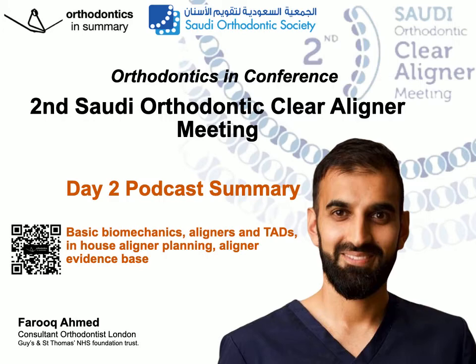So Tommaso started off describing the advantages of using aligners for periodontal patients, how their health outcomes are better with respect to gingival index, bleeding on probing, that was shown by Rossini in 2015. The real advantages are that we can control the rate of orthodontic tooth movement for these periodontal patients by reducing down the linear movements to 0.12 millimeters and angular measurements to 1 degree, essentially half the typical velocity, and therefore control the biological response in a more organized fashion.